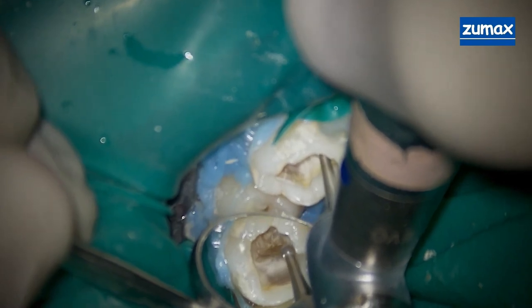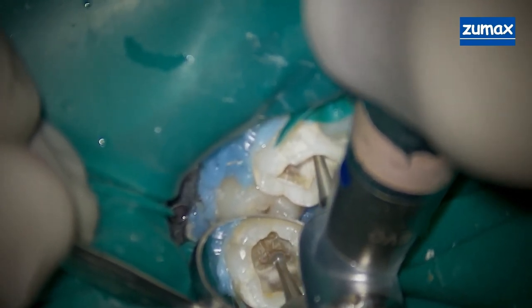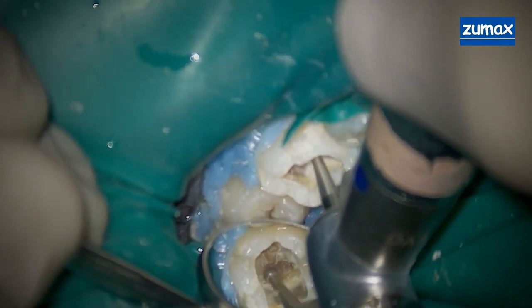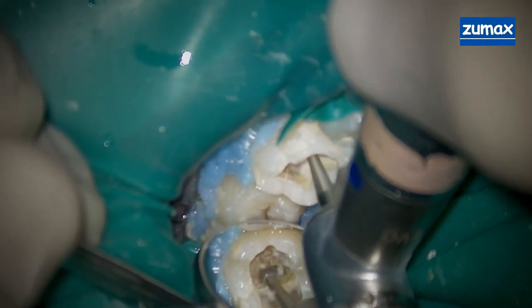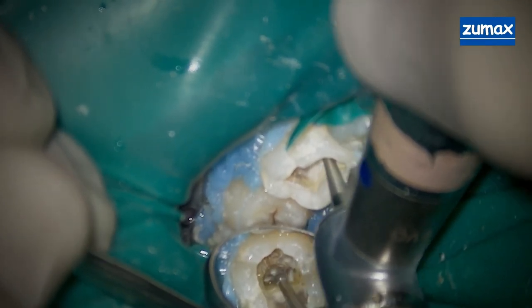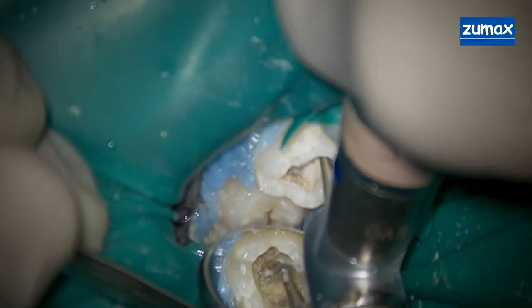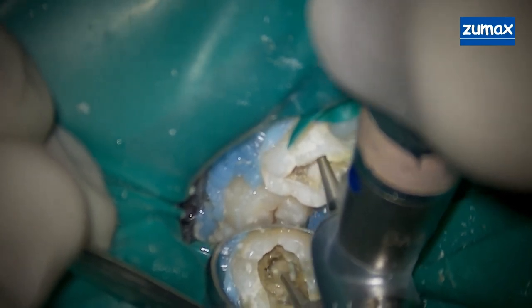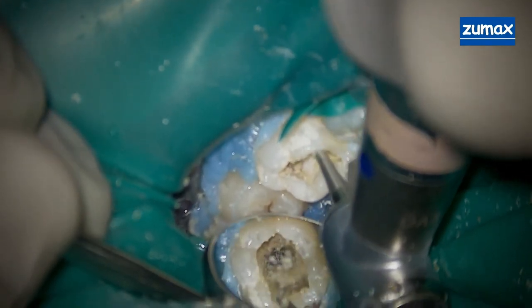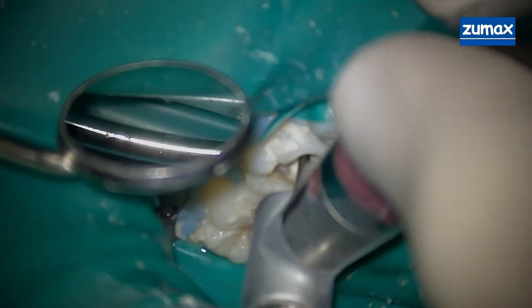At this point we've removed the caries and we are extending into the pulp chamber. You can see we're using a slow speed handpiece with a number 6 round burr, slowly removing tooth structure until it drops into the pulp chamber. If the pulp chamber isn't calcified, that's something you're going to feel very distinctly.